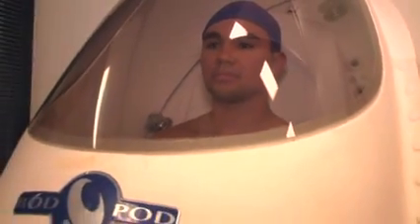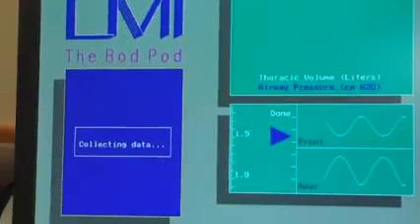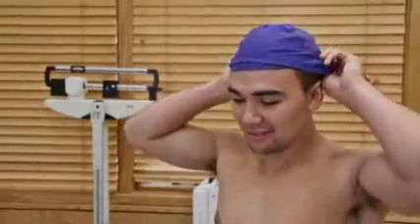The Bod Pod, however, is much safer and more practical than underwater weighing. After finding the density, lean and fat mass is calculated. To ensure accurate results, the participant must wear form-fitting clothing such as biking shorts and a swim cap. Loose-fitting clothing creates an inaccurate reading.